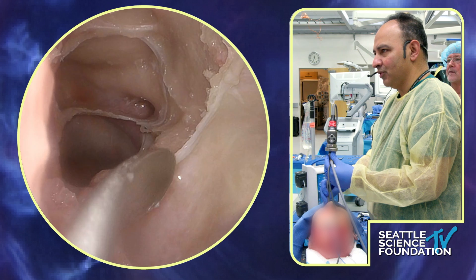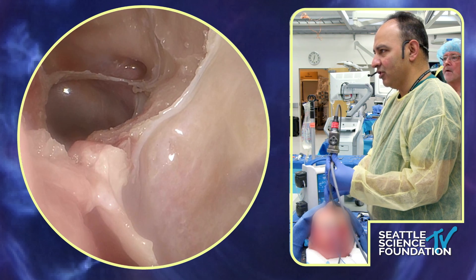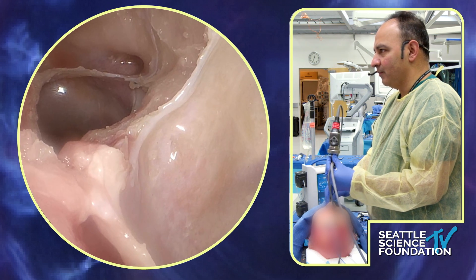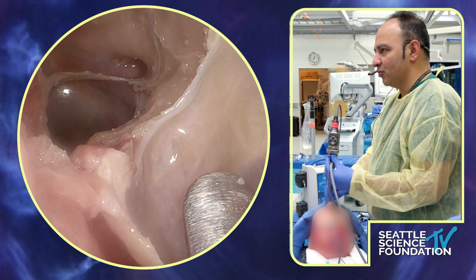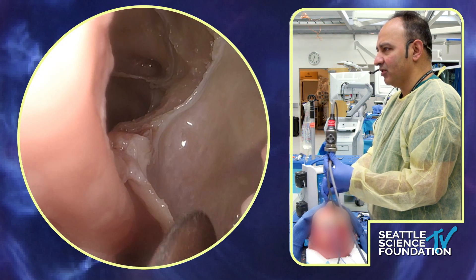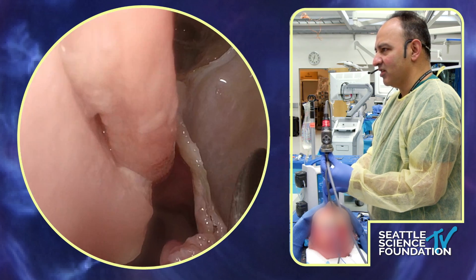The old approach was to crack open the shell back here. You can actually see where the artery is in this case — it's making a very tortuous run from lateral, working its way through here, and then exiting along the posterior wall. When you do a sphenopalatine artery ligation, I always like to make a wide maxillary antrostomy so I can landmark where the back wall is, though it's not strictly necessary.